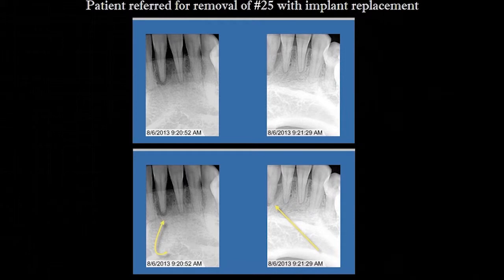And it's like, look at that. I'm just going to take this tooth out. We're just going to put an implant in. And with a conventional X-ray, it certainly looks like you could. But look what's going on down here.